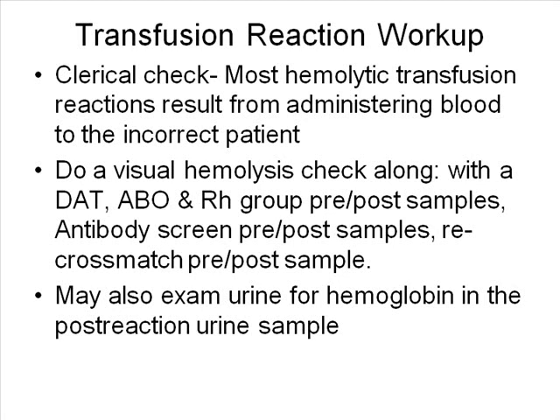Okay. You can also look in the urine to see if there's hemoglobin in it. Look at the pre-transfusion urine to see if it's clear, and the post-transfusion urine to see if it's positive for blood. Remember, the dipstick will give you a positive for hemoglobin.